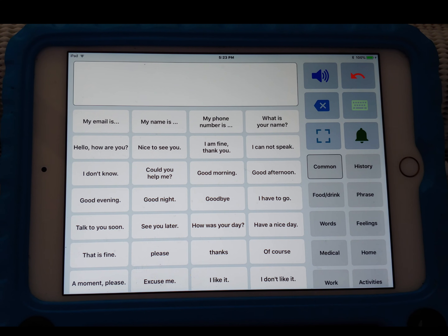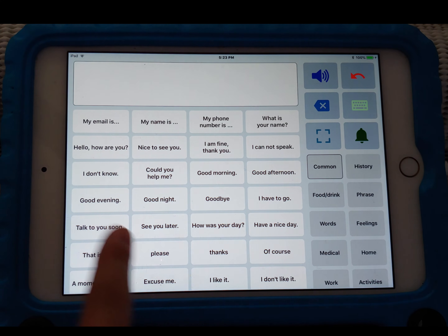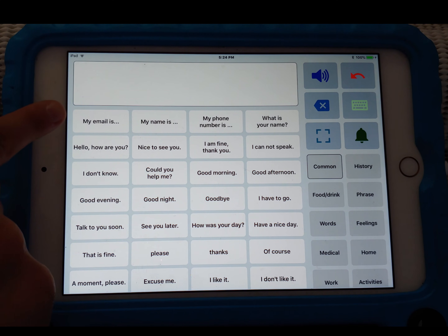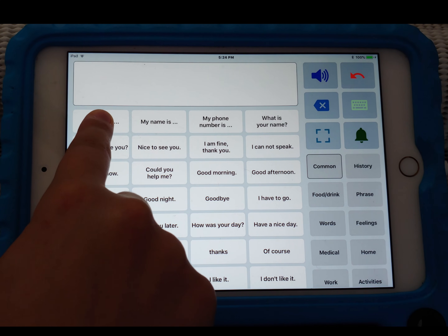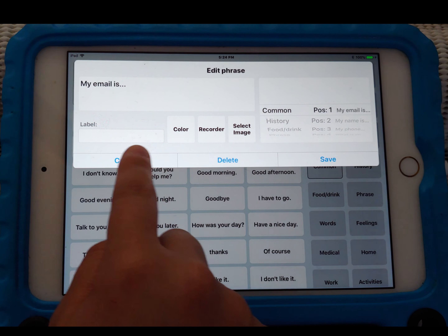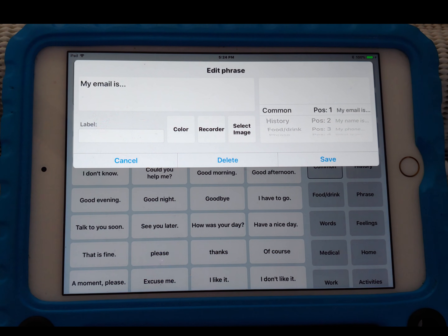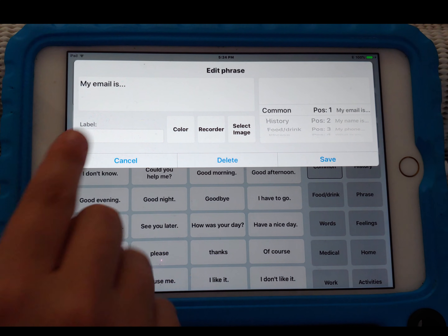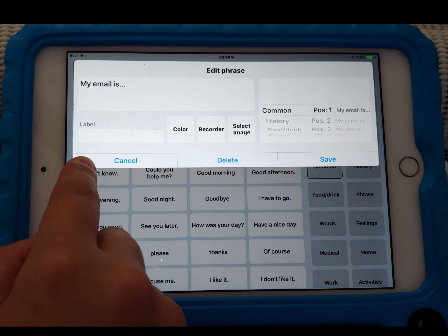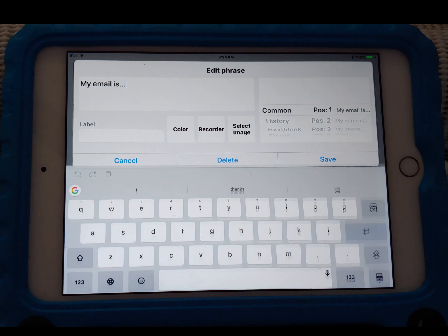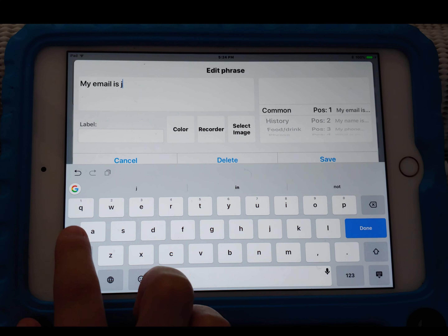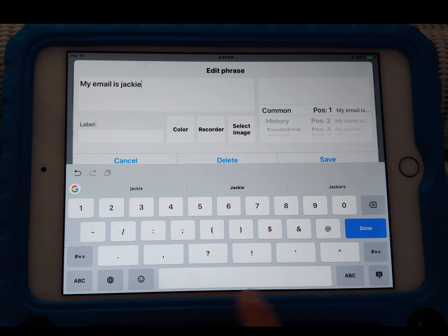Now I'm going to teach you how to modify the buttons on this device — the quick access phrases and categories. If you want to change one of these, say you want to change 'my email is' and populate it, you do a long press over the button. It gives you a pop-up where that phrase is written in a text box, just like the one on the homepage. You press into that text box, it opens the on-screen keyboard, and you can start editing.